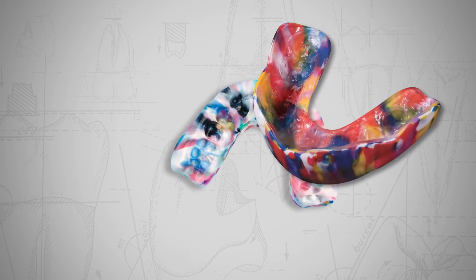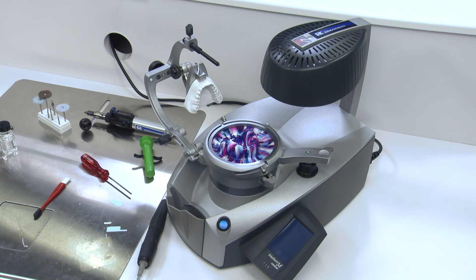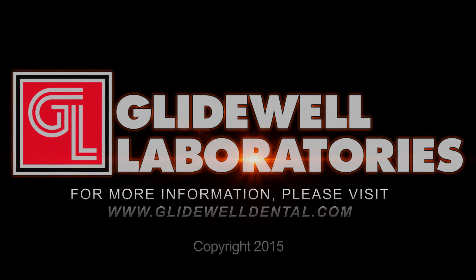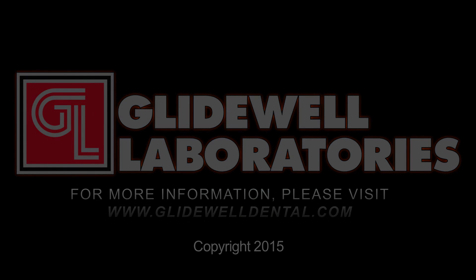Thermoforming world-class occlusal appliances has never been so easy. For more information on the ERCOFORM 3D Motion or other thermoforming supplies, visit our website at www.glidewelldental.com.